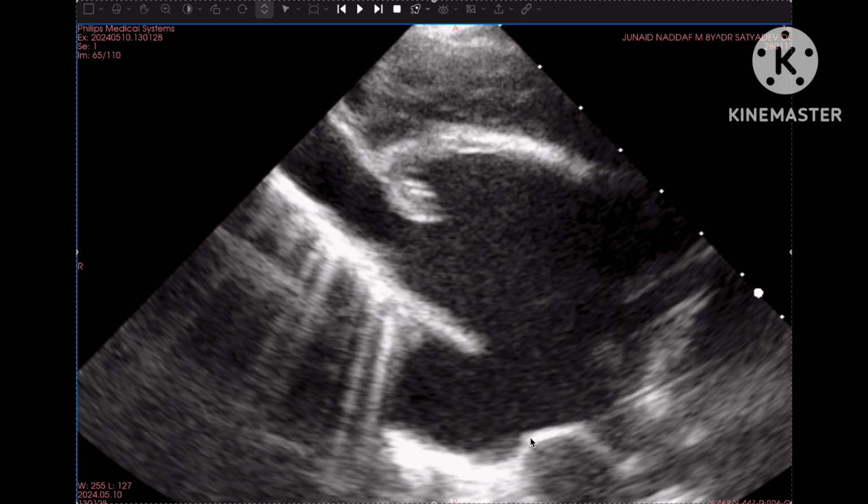So sinus venosus ASD always has abnormal pulmonary venous drainage. In case of SVC type, right upper. In case of IVC type, right lower. Because this left atrium portion is the right side, because the IVC is on the right side. Compared to the aorta, the IVC is always a right-sided structure in the abdomen, in the subcostal window. What you see, the IVC is a right-sided structure. The SVC is also a right-sided structure.